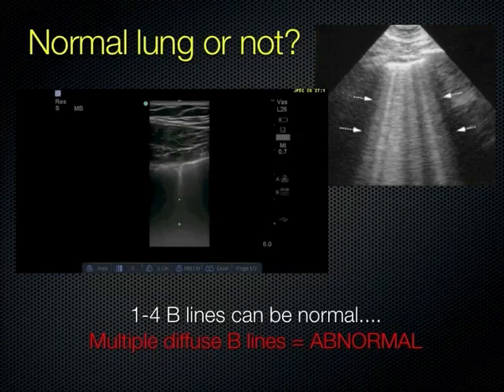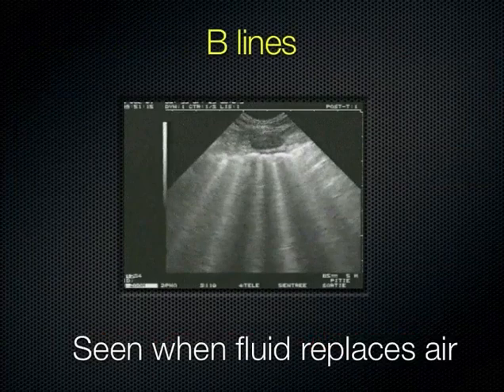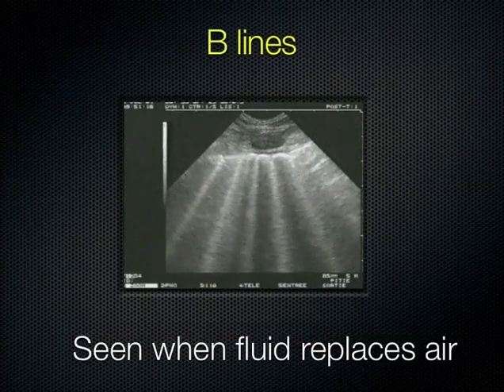Here is an in-motion picture of what B-lines look like. The fluid is replacing the air — it looks like a light show. There are multiple B-lines going all the way to the edge of the screen, and the A-lines have disappeared.